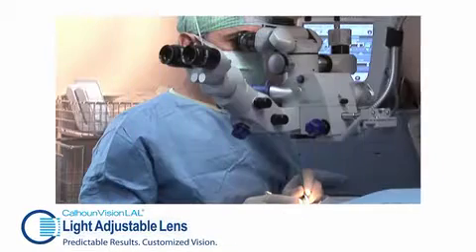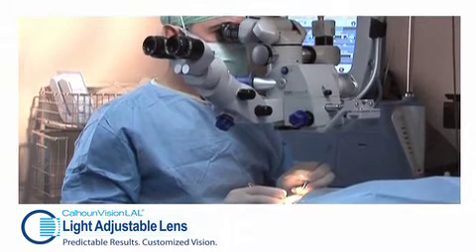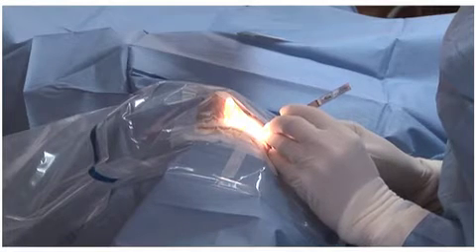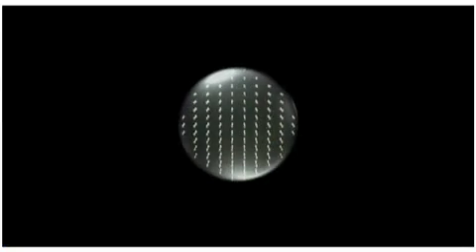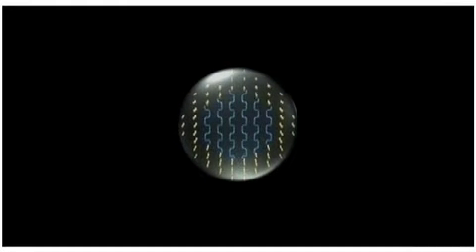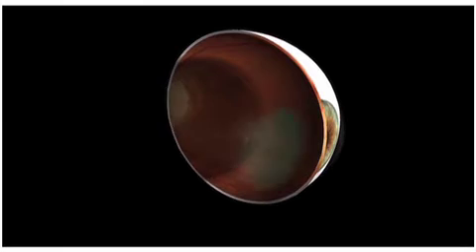The light adjustable lens, the Calhoun vision lens, is a remarkable advance for the correction of pre-existing sphere and astigmatism at the time of cataract surgery. This innovative concept is based on the use for the optic of the lens of a polymer that is not completely polymerized before surgery, and whose polymerization will be modified with UV light once the lens is in place within the eye. The spatial control of the delivery of the UV light during the adjustment process makes it possible to change very precisely the optical geometry of the lens after the surgery is done.